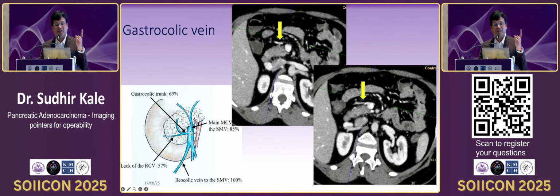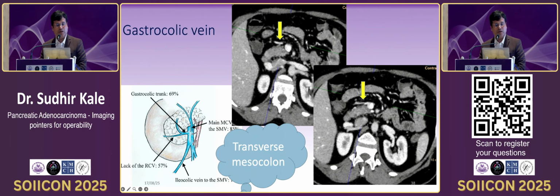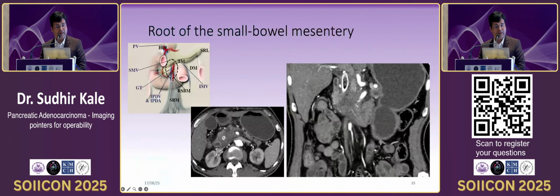If the tumor is involving this particular structure, this patient might end up going for transverse colon resection. Right? So you can always give them a heads up that this particular vein is encased, infiltrated, so they will be well prepared, because it's an extension of the surgery.